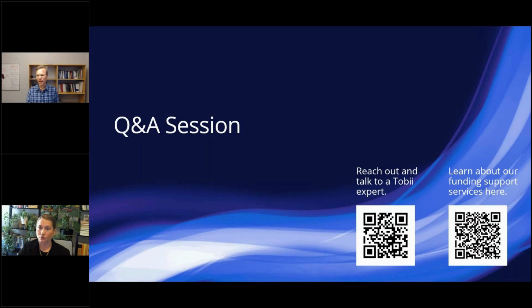Okay. What about participants with glasses? Did you find any issues? Do you have any participants who are wearing glasses in your sample and any issues with that? We didn't look at that specifically, but in general, when it comes to glasses and eye tracking, with the Spectrum, which I have the most experience with, you can record maybe 9 out of 10 people without a problem, irrespective of whether they have glasses or contact lenses, from a normal student sample. And of course, if you have some very specific glasses with really large, strange frames, or bifocal glasses, or something like that, you can have issues.